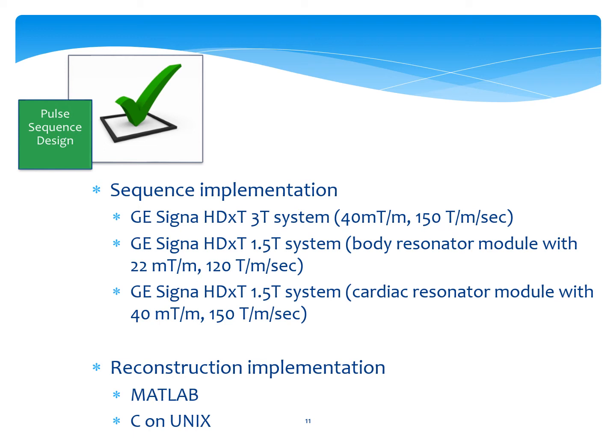The Steer-Prop sequence was implemented and evaluated on 2 General Electric MRI scanners operating at 1.5 Tesla and 3 Tesla. Specifically at 1.5 Tesla, we used 2 different hardware configurations. All image reconstruction and post-processing was implemented using custom programs written in MATLAB and C on a Unix environment.